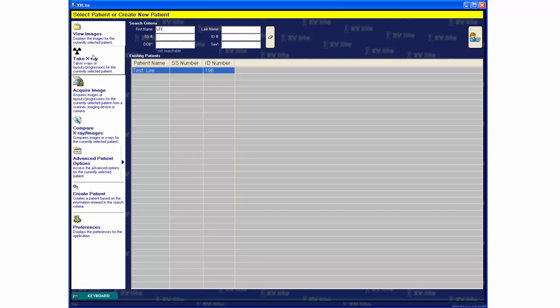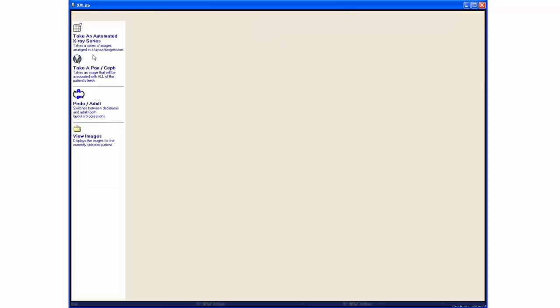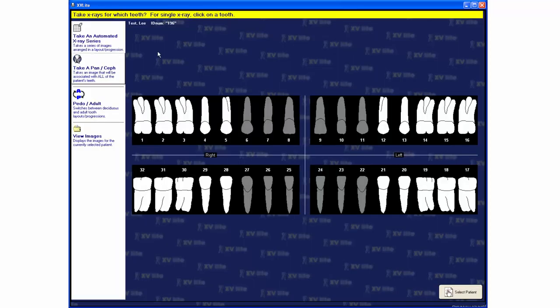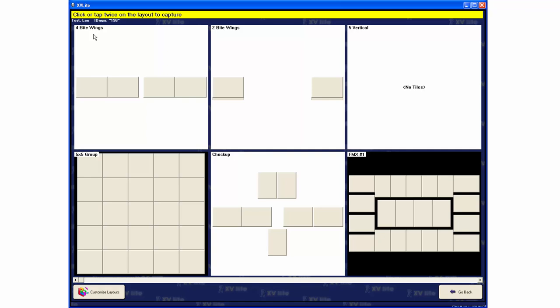First choose a patient, then take an automated X-Ray series, then choose an X-Ray layout.